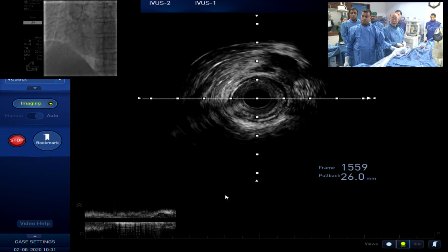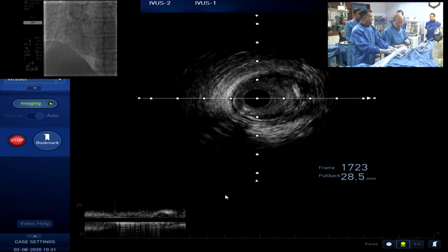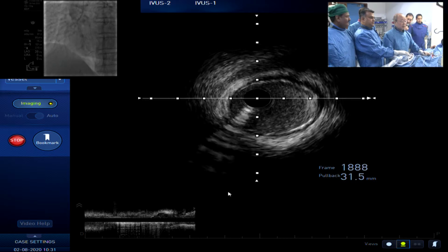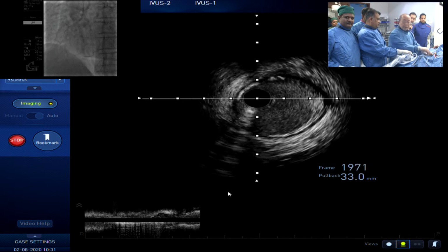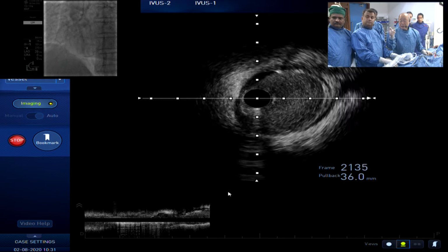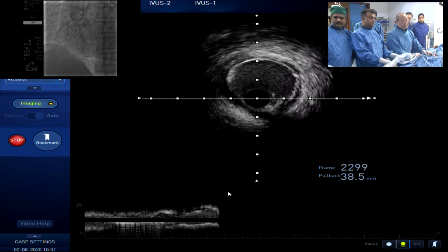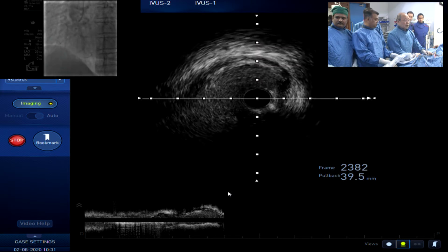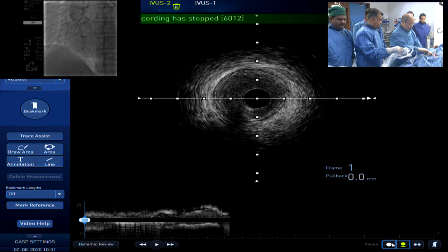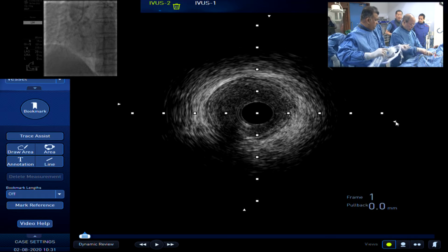Dr. Saito, are you surprised? No, I'm not surprised. But from the angio, it looks like your wires are outside first and then go in. So from the IVUS, we need to review a little bit. The vessel size is 3, 3.5. So the calcium is not much, right? There's only one nodule of calcium that you could see, so I don't think a rotablator would probably add much value in this case. No, not useful.